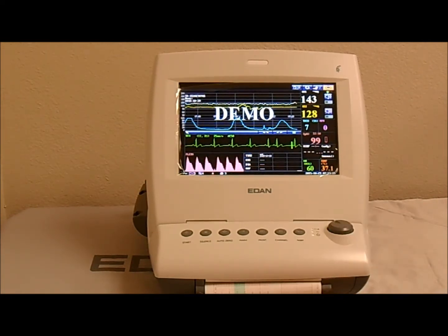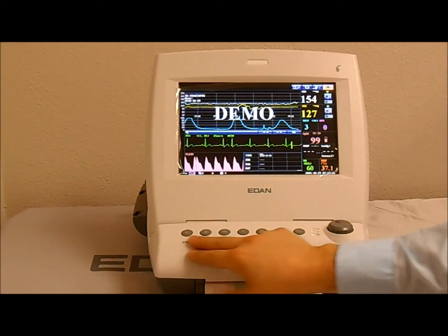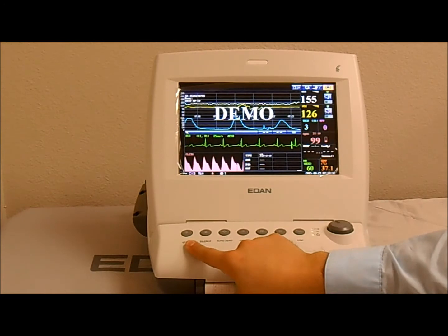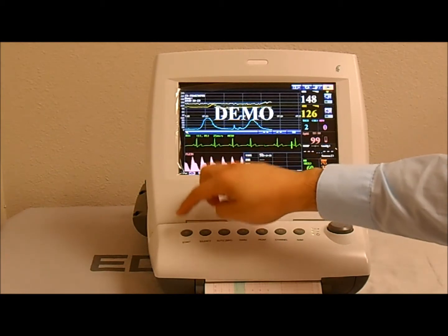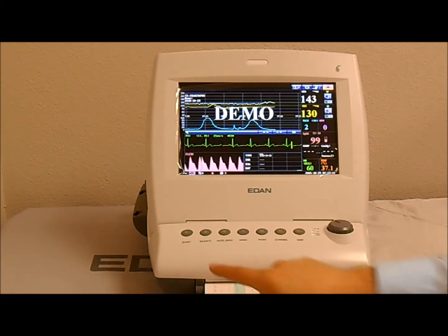Okay, now that we have the paper properly inserted, let's review some of the features of the monitor. We'll start with the keypad. The start key is the operation that tells the monitor that there's a new patient. So once you have the patient connected and all the sensors on, press start, and this will refresh the system to begin a brand new session, which indicates that this is a new patient.